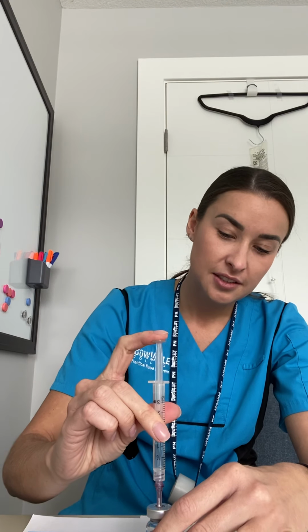We have this, and we can loosen the syringe so that we don't have medication squirting all over. Okay, so we want to safely take off the cap here. And then to withdraw medication in a vial, we're going to have to put in air to withdraw. So let's put in about 1.5 milliliters of air into the vial.